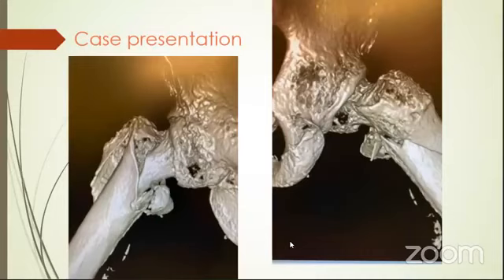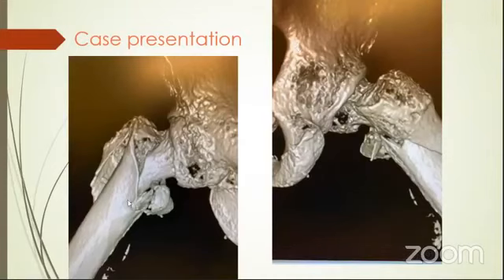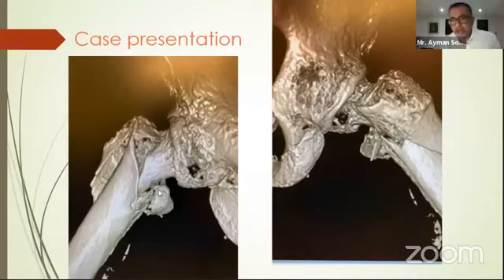Dr. Ayman, do you hear me? Yeah, I can hear you. I would definitely agree it's an A2 because the fracture seems to be above the lesser trochanter. Yes. The A23s are those who extend more than a centimeter distal to the lesser trochanter, which doesn't seem to be the case here. So this looks like an A22.